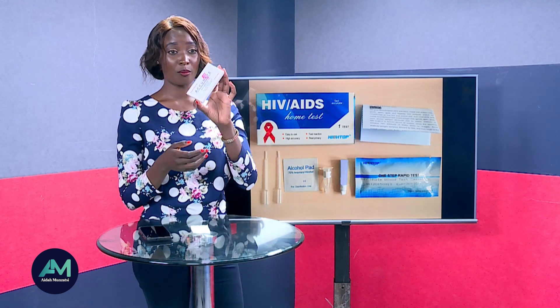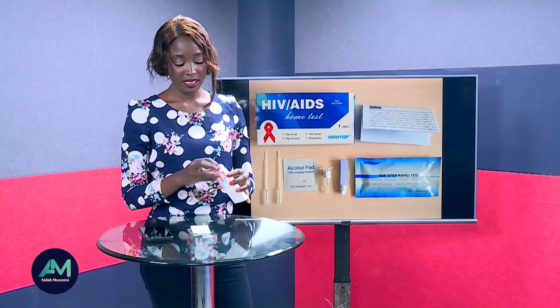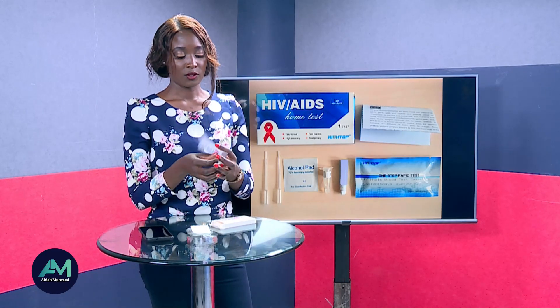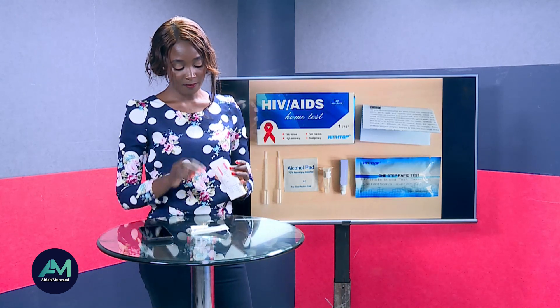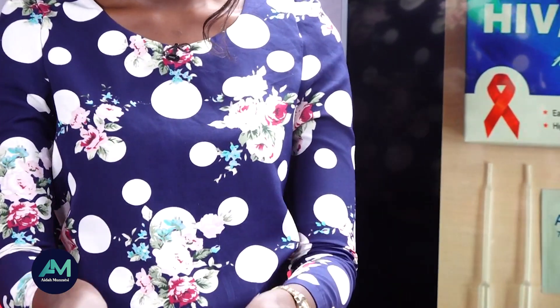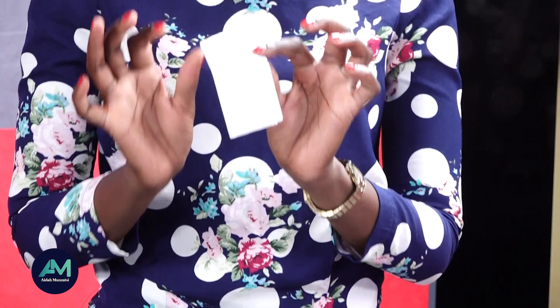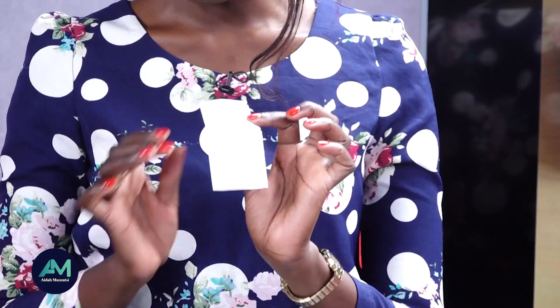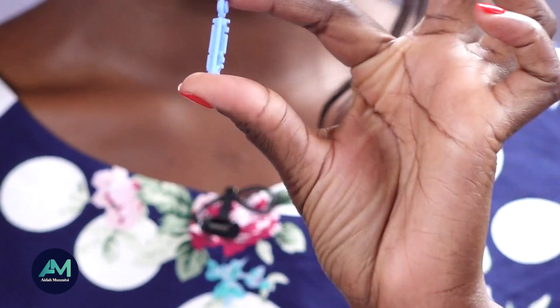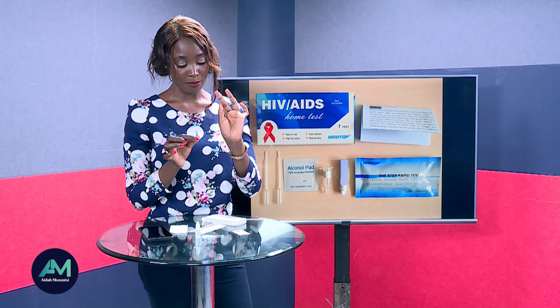We'll start by looking at the components of the rapid HIV test kit. We open it up — these are some of the components right here. This one here is known as a lancet; this is what you'll use to prick yourself to get the blood sample for the test.